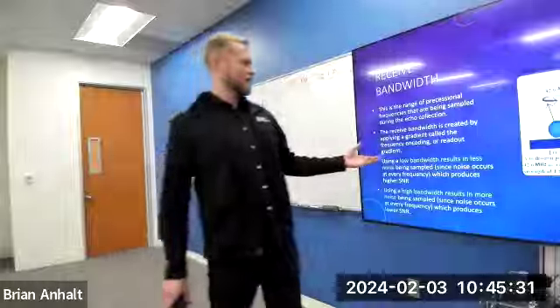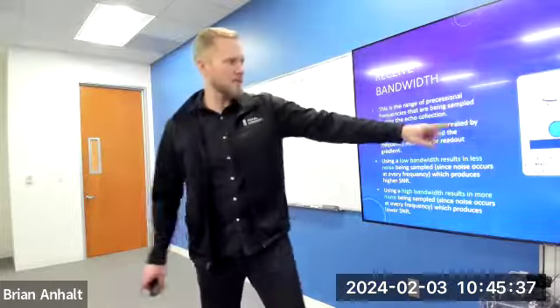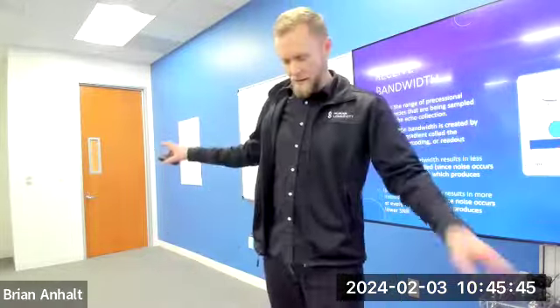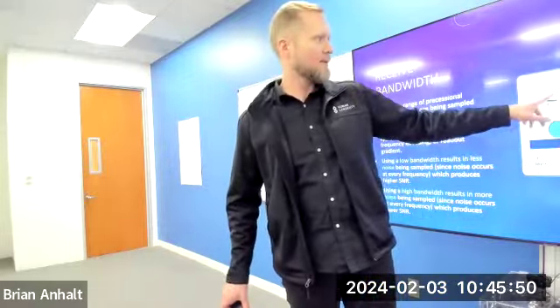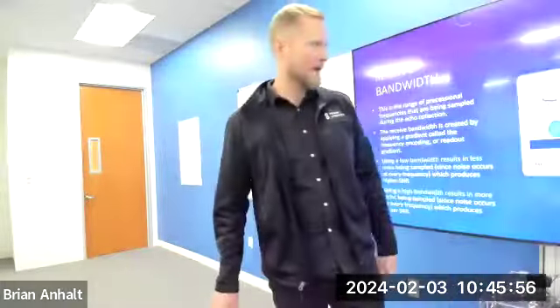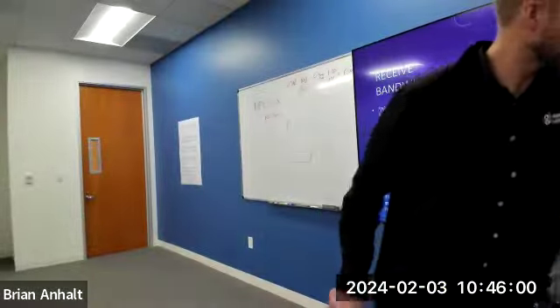This is done by putting on a gradient, called our frequency encoding gradient, during the echo collection, right? So we see right here, this is 42.6, right? That is our center frequency at a 1 Tesla magnet. If we turn a gradient on, the center of the magnet will still have protons precessing at 42.6. But some of them will precess higher on one side and some of them will precess lower on the other side. Or we can see here, we're not showing the other side. We keep going down this way.